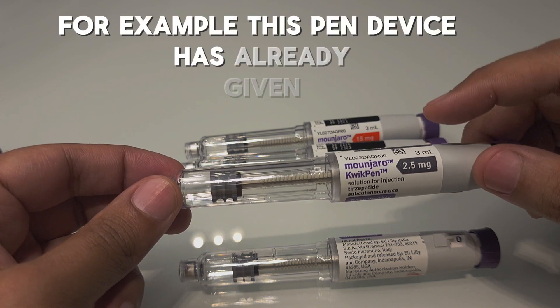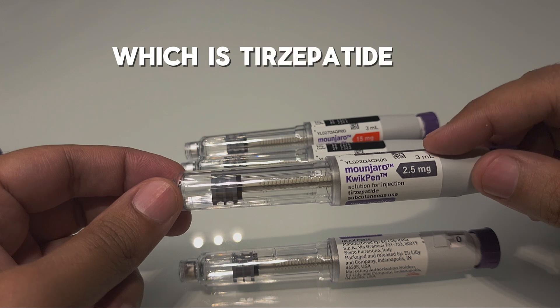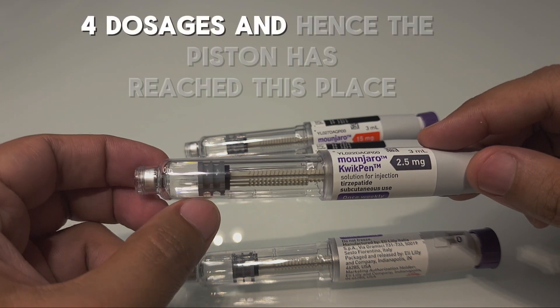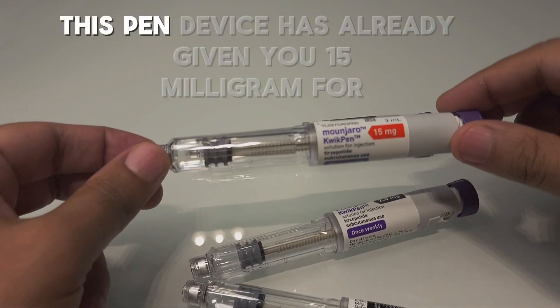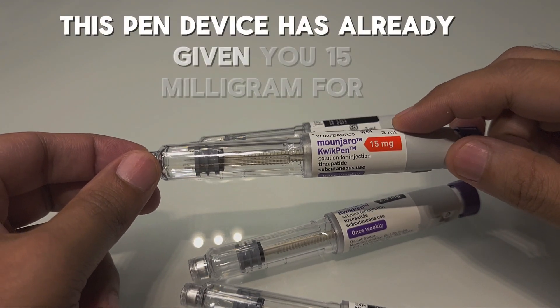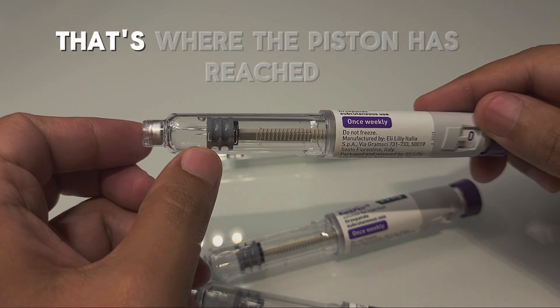For example, this pen device has already given 2.5 milligram Mounjaro — which is tirzepatide — four dosages, and hence the piston has reached the last calibration. Similarly, this pen device has already given you 15 milligram four dosages — that is where the piston has reached.